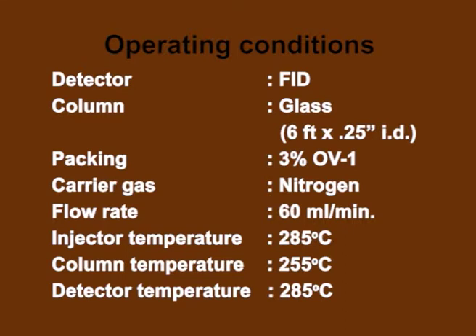Preparation of standard solution of heroin hydrochloride and triacontane internal standard in chloroform having a concentration of about 0.3 and 0.4 milligrams per ml respectively. Prepare a working N-triacontane internal standard solution in chloroform having a concentration of 0.4 mg per ml. Dilute an amount of sample with the working N-triacontane internal standard solution to give a final heroin hydrochloride concentration of somewhere between 0.08 to 0.5 mg per ml. Inject sample and standard solution into the gas chromatograph under the operating parameters given above.